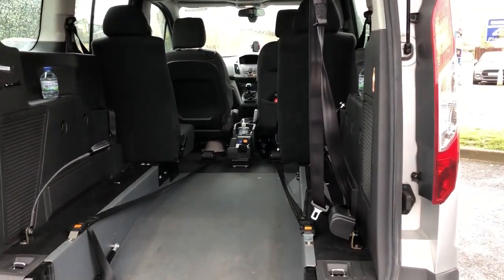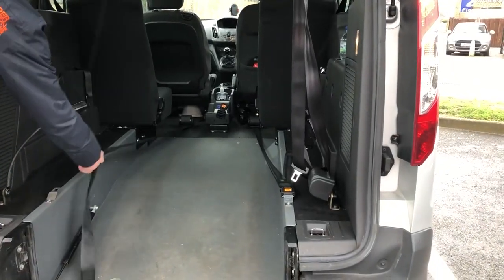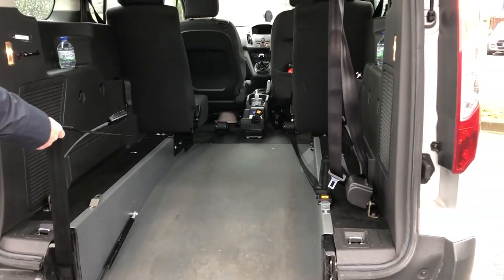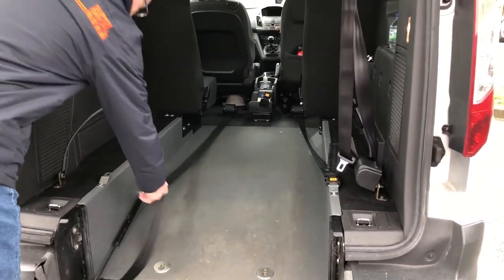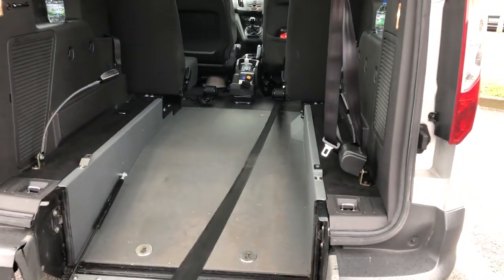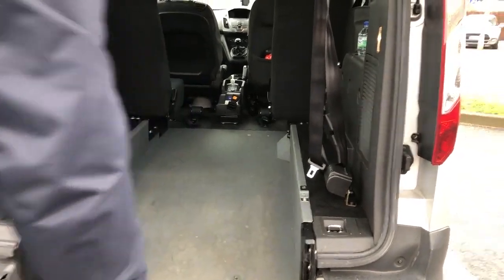Switch that on, pull that strap in. Leave it inside, all the way — leave it, it will go all the way. Then pull both things and strap it here.